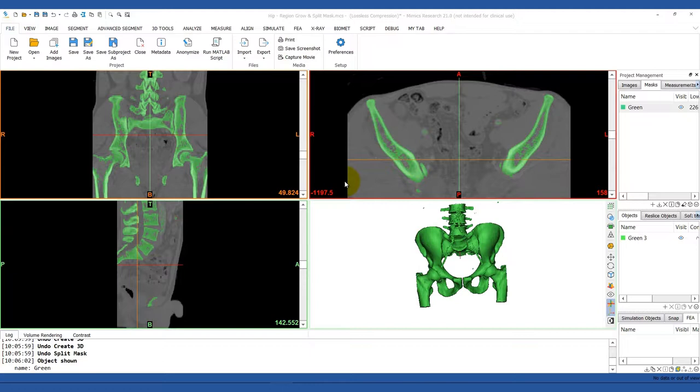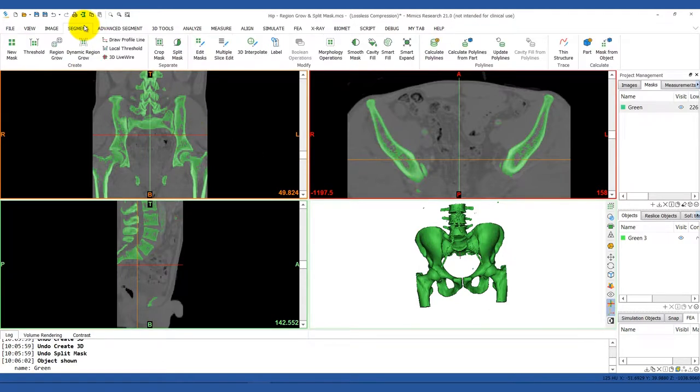Let's say that you want to split off the sacrum from the rest of the pelvis. In the segment menu, click on the split mask tool.